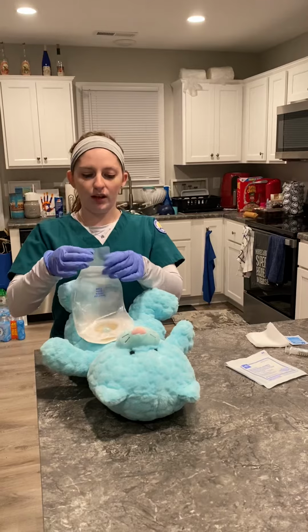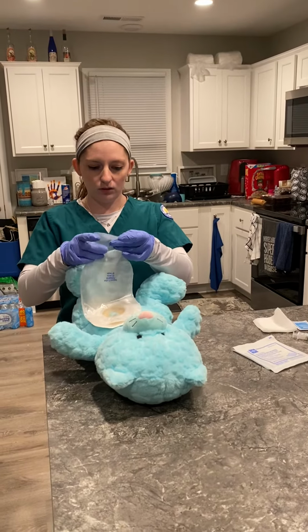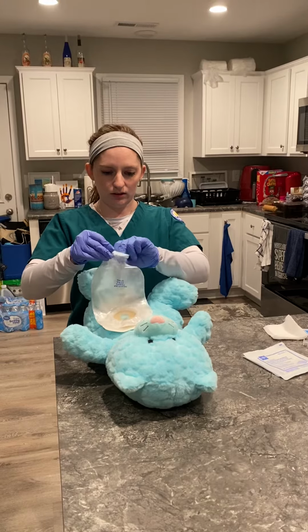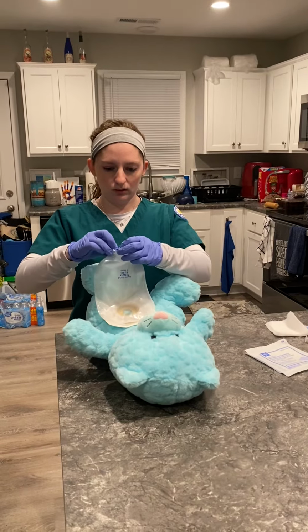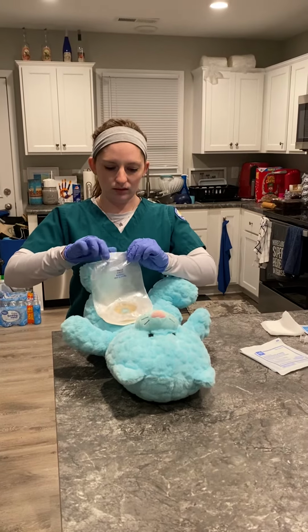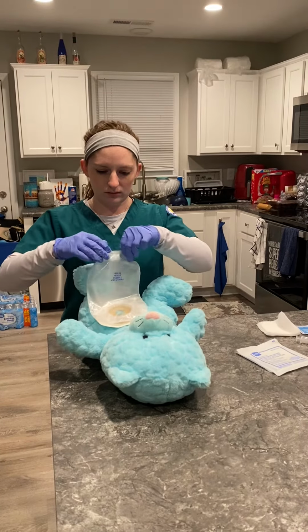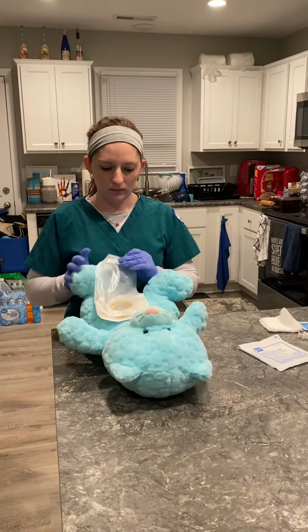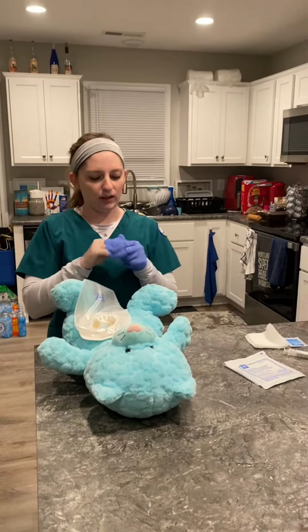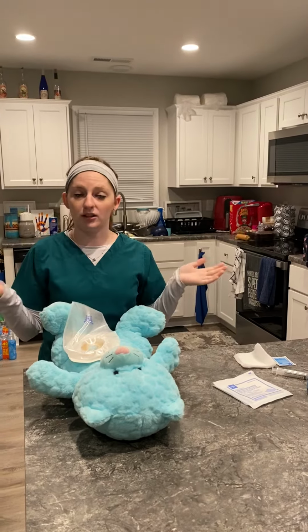And then if you have a clip, you would clip it, or you can roll it down into the little protective case. Make sure it's all even. Everything's good. Take off my gloves, wash my hands, and I will document my procedure.